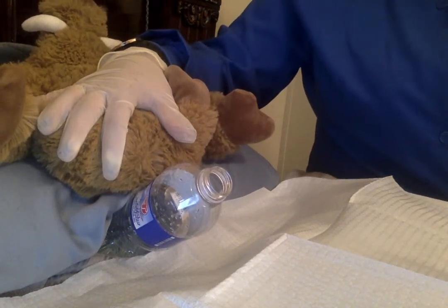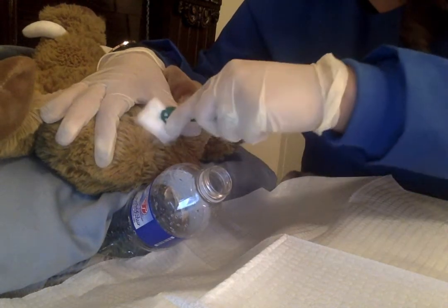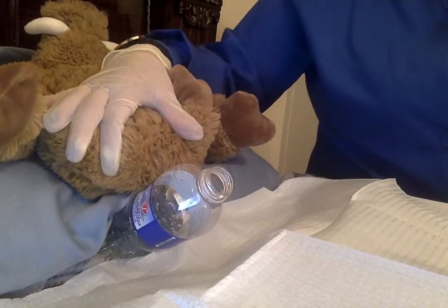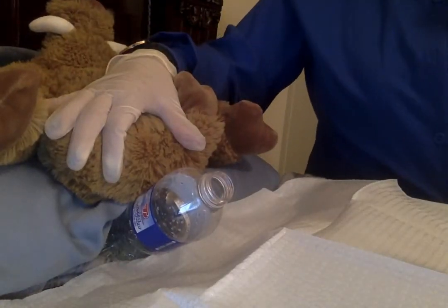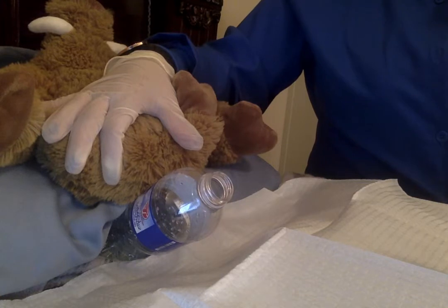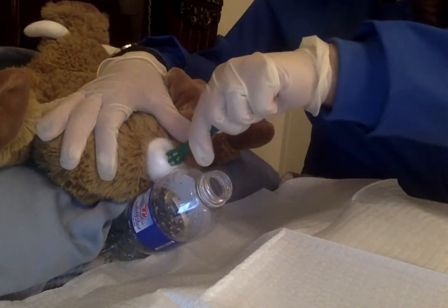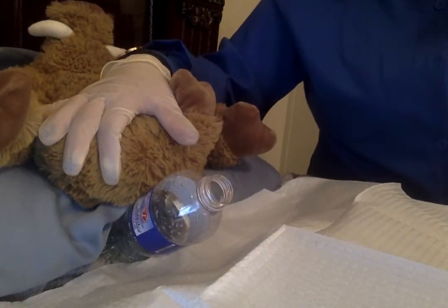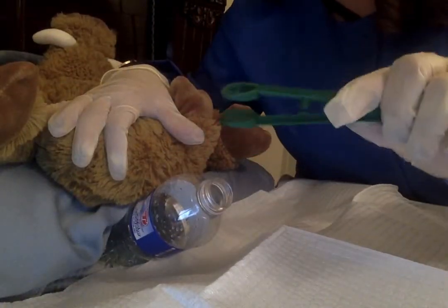We are going to take the cotton balls, and we're going to clean. Throw that one away. Get another cotton ball. Clean. Throw it away. More cotton balls. And we are going to clean the middle. And then we are going to take the rest of the cotton balls, all of them, and clean the middle again. We're going to throw all of this away, even this. We're going to throw it all away.